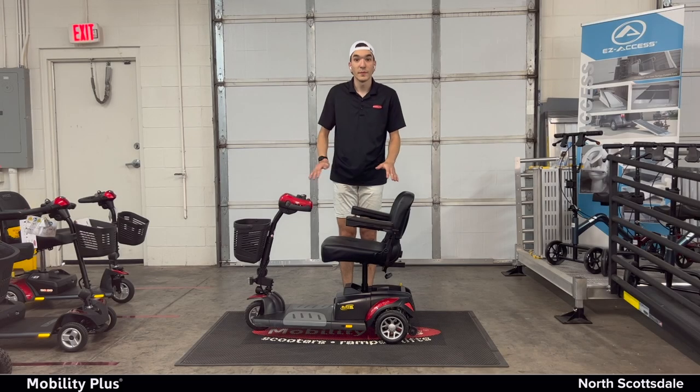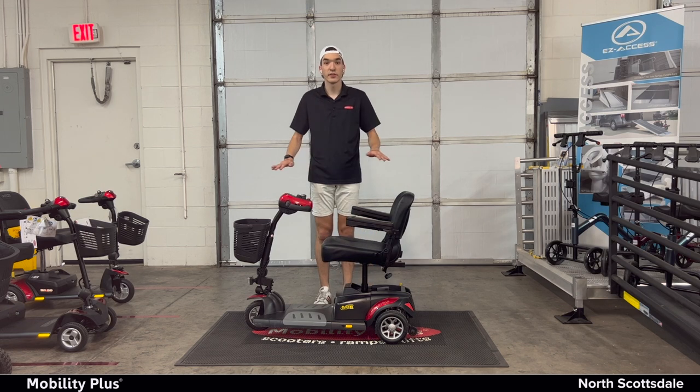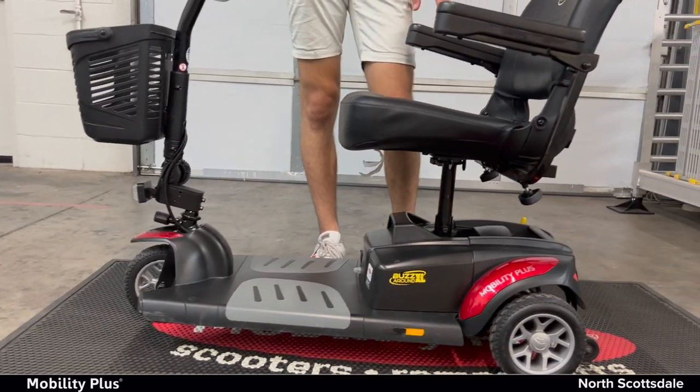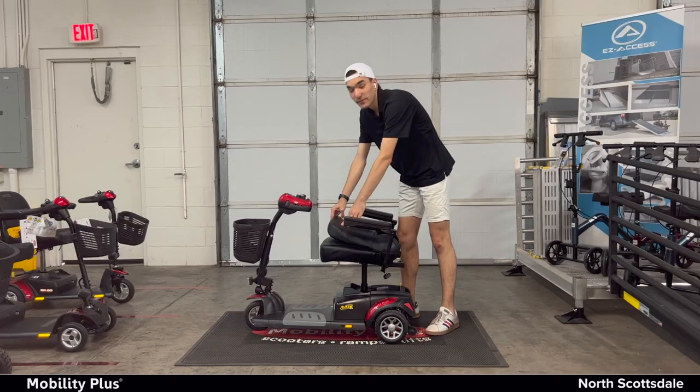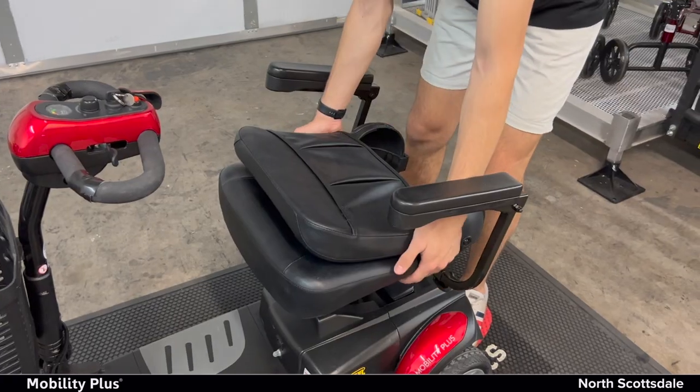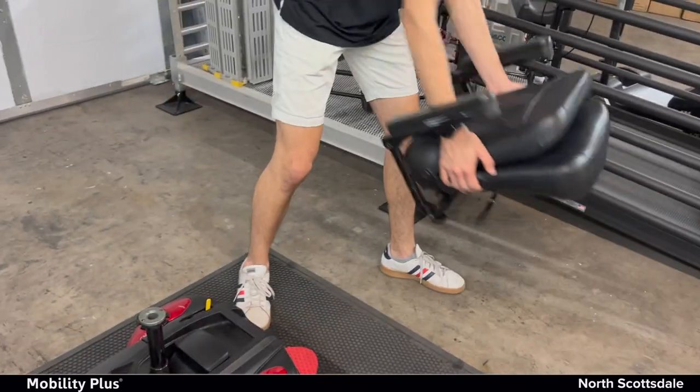First thing you want to make sure is that your scooter is level with the ground and that it's turned off. Next, we're going to put the seat down. This is the first step. Put the seat down — simply lift it up.